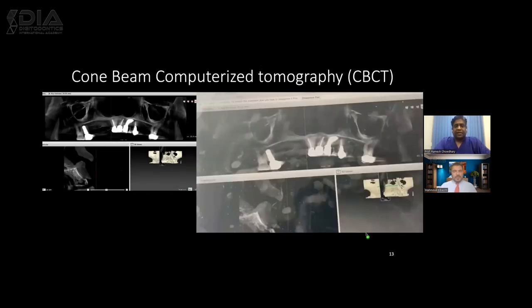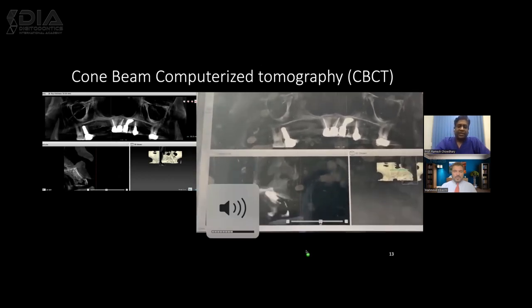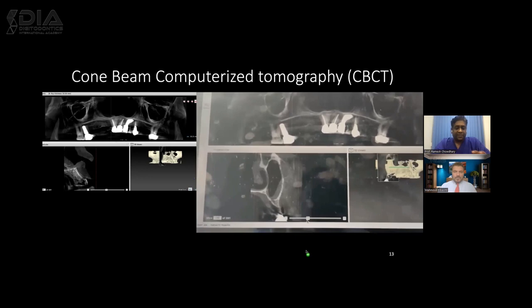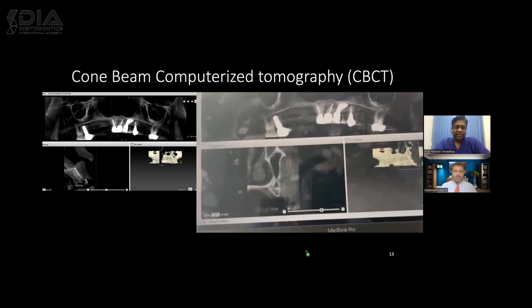But yes, CBCT has really brought a first digital evolution in dentistry, for most of the specialty practice in dentistry. Because these CBCTs have helped us understand and simplify the planning procedures, and we can explain to the patients that, okay, this bone is not there and you may have a problem. Probably you may have to go for some advanced surgeries.